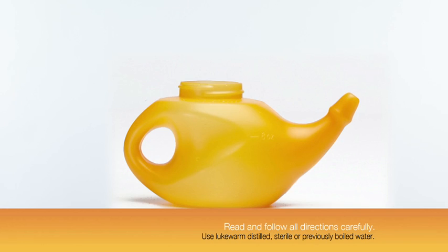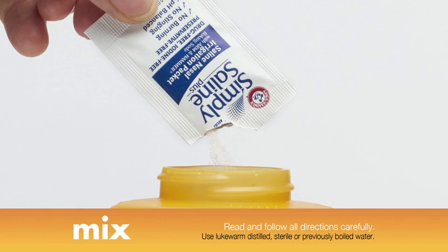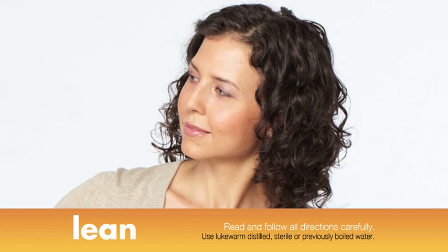Here's how simple it is to use. First, fill the orange neti pot with warm water to the indicated fill line. Then mix in one saline packet which contains only salt and real Arm & Hammer baking soda. Next, tighten the lid and carefully shake the pot until the solution has dissolved.